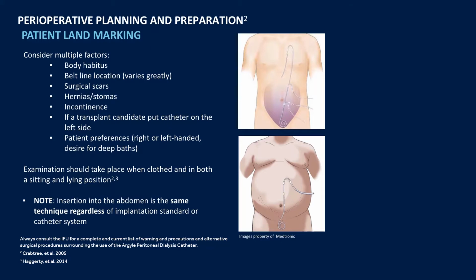Examination should take place when clothed and in both a sitting and lying position. Note, insertion into the abdomen is the same technique regardless of implantation standard or catheter system.